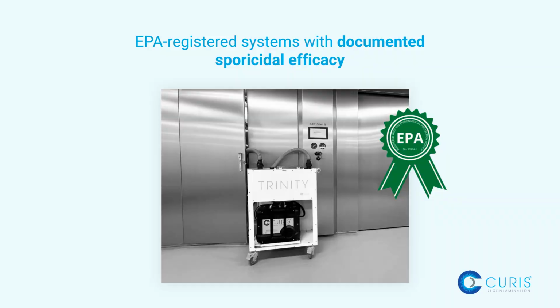Some facilities discover this the hard way, switching solutions without proper validation, only to see failed biological indicators and incomplete sterilization. That's why it's critical to use EPA-registered systems with documented sporicidal efficacy, and to validate your specific process, not rely on assumptions.